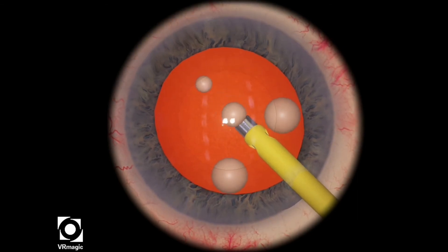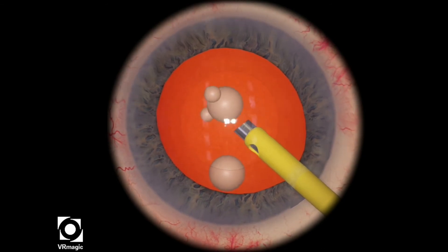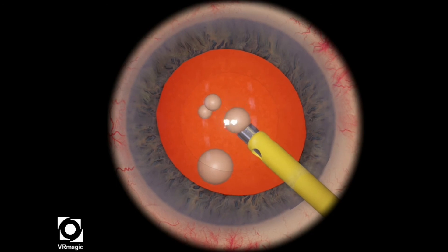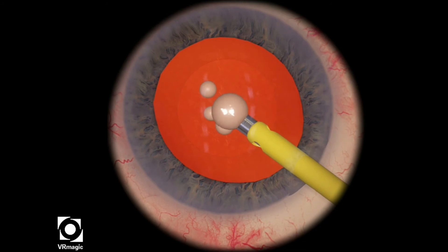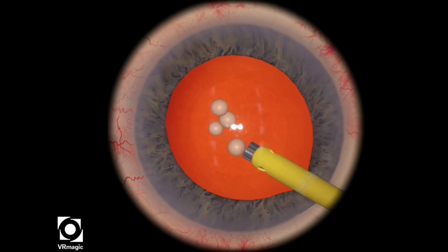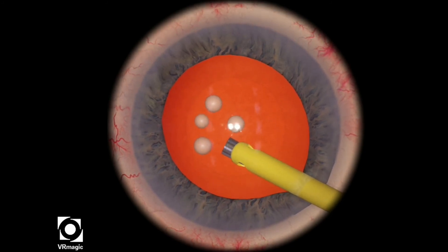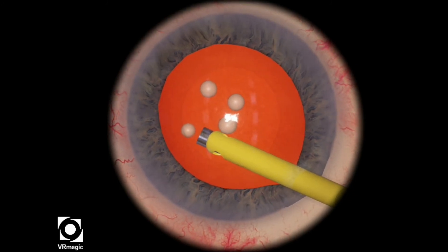Each ball needs about 35 to 40% FACO energy to start bringing it down to a smaller piece, but you're not supposed to consume each piece at a time. What you're really supposed to do is make four small balls, so that when you consume or use ultrasonic energy and aspiration, your tip is not unoccluded at any particular moment in time.